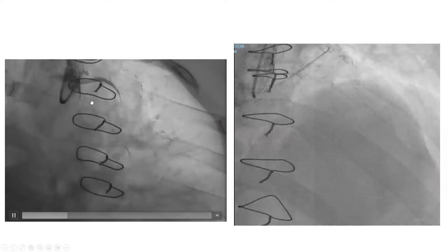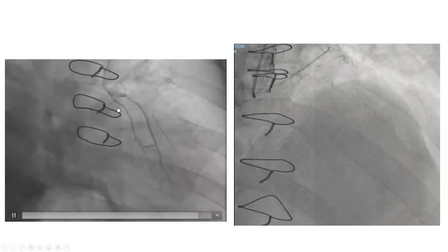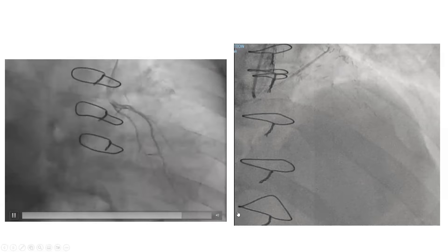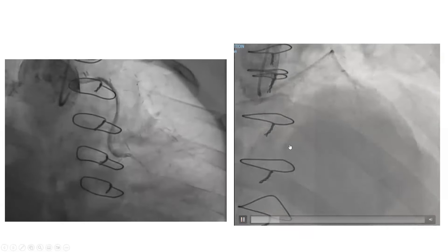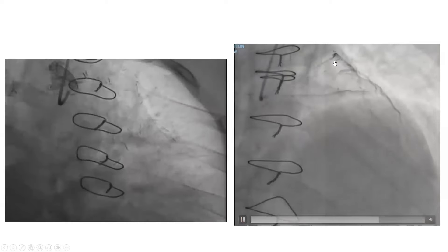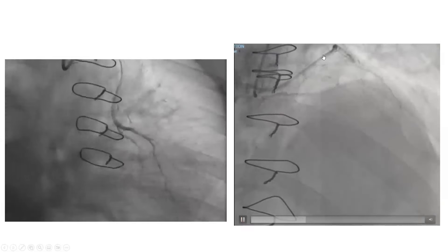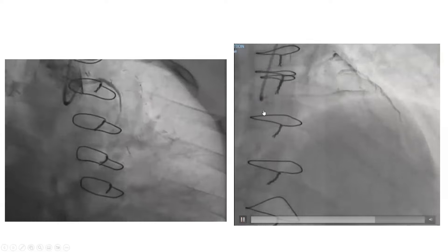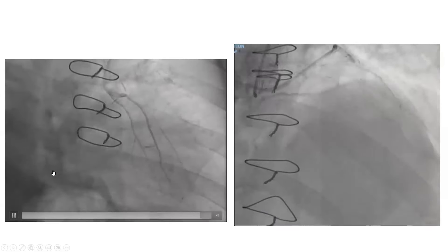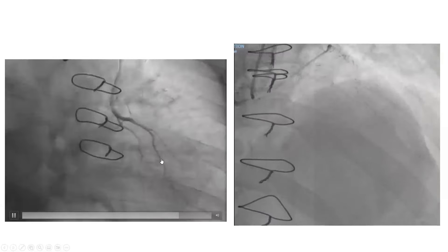We engaged the graft to the ramus. But the graft to the ramus is disconnected from the native system — it has a 100% ostial occlusion and is not feeding the LAD. This injection shows both the graft to the ramus on top and the graft to diagonal on bottom. So that graft to the ramus is not feeding the LAD — there must be a LIMA to LAD.